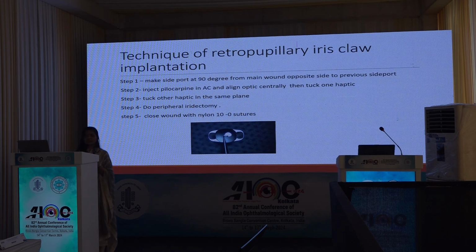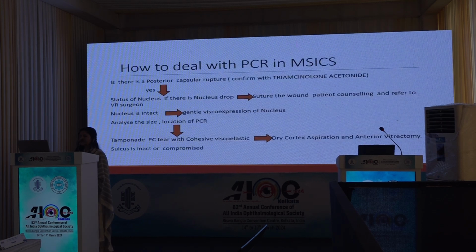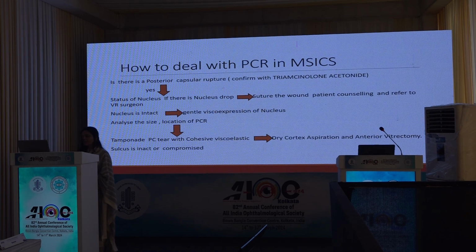My next talk is surgical outcome of the iris claw lens in complicated cataracts. Now, how should we deal with the PCR in cases of manual small incision cataract surgery? We should first see whether there is a real PCR or not. Whenever we are in a dilemma, we should confirm it with triamcinolone acetonide injection into the intracameral site.